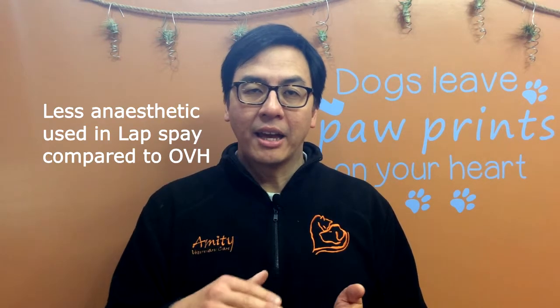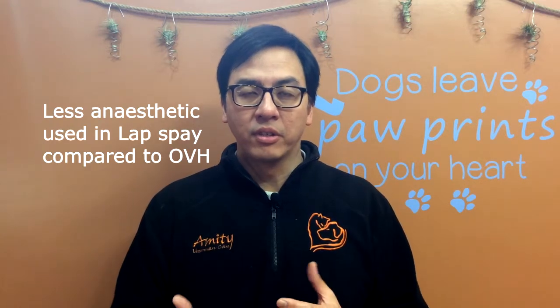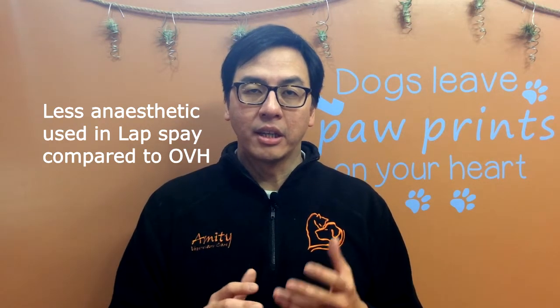So with that in mind as well, reports have said that the anaesthetic depth, or rather the use of anaesthesia, is much less in a minimally invasive surgery like lap spays and keyhole approaches, rather than the open traditional spay. So that is why we favor the lap spays a bit better.